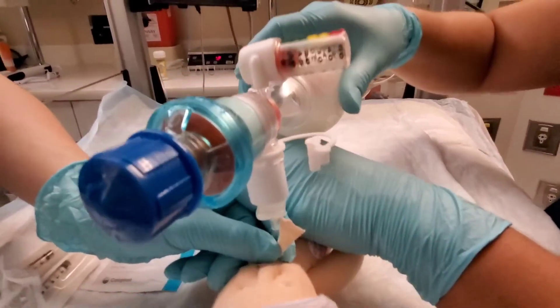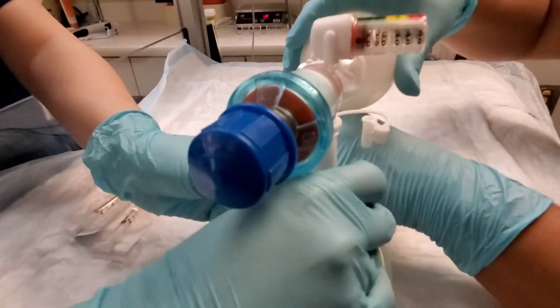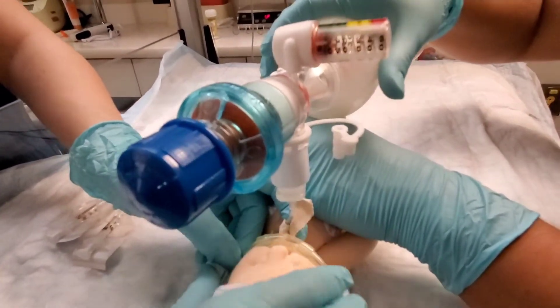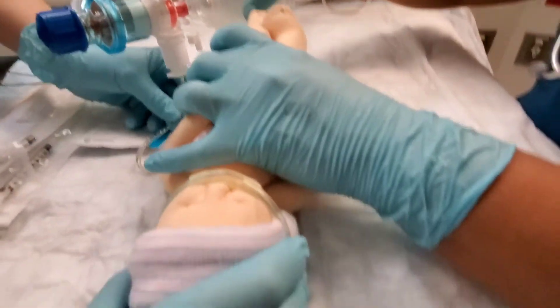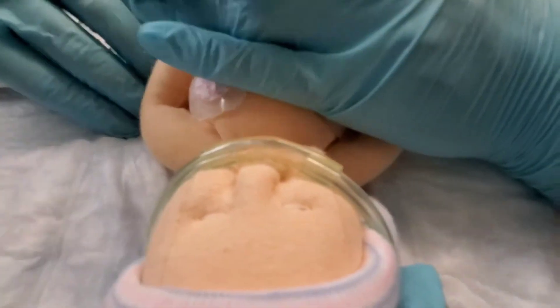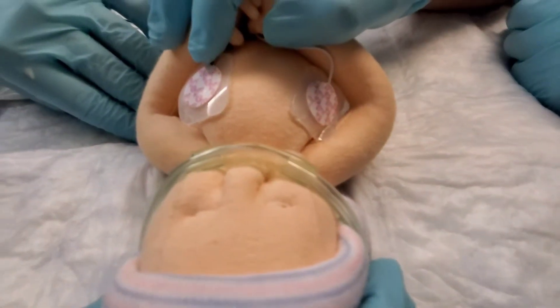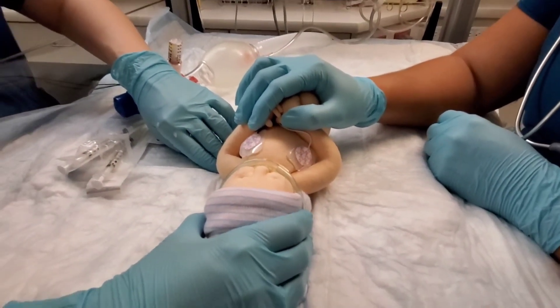We're still monitoring the heart rate and the saturations. Now before we actually take the tube out, we're going to support the baby with the CPAP or whatever device we're planning to put the baby on. So the tube is out. And if you notice, it's in the nose — we're supporting the baby as the tube comes out. Very good. Good job, everybody.